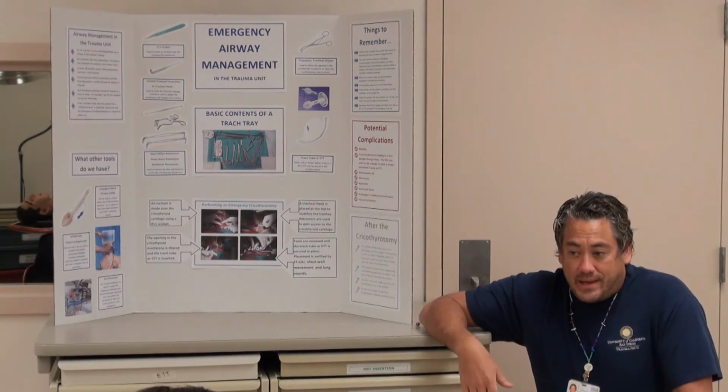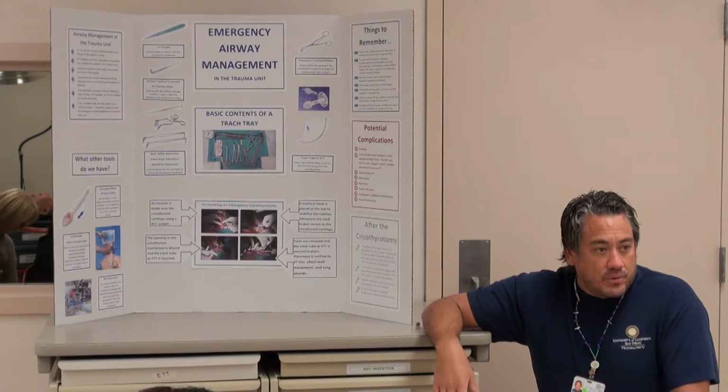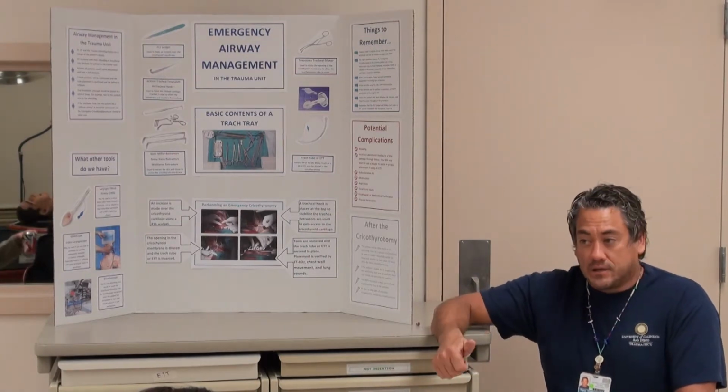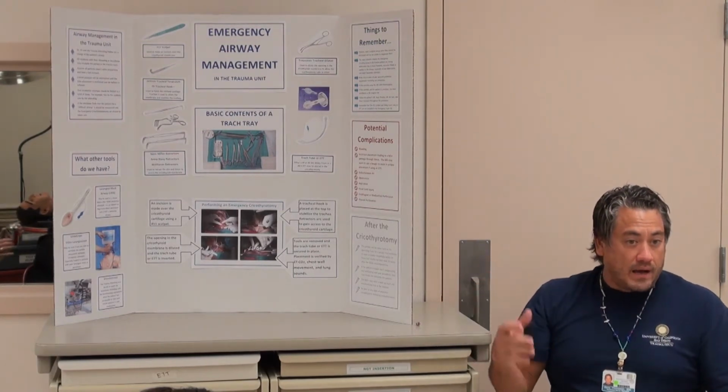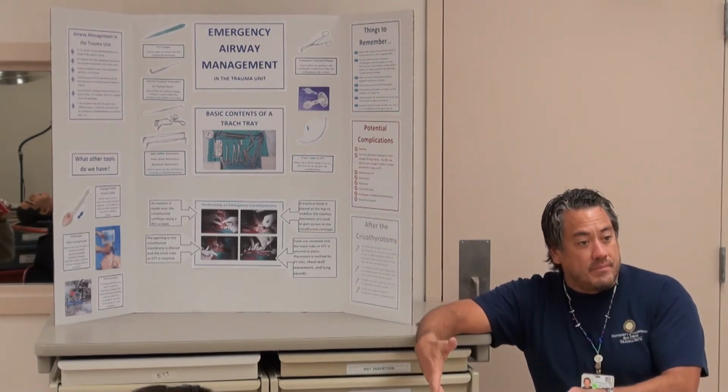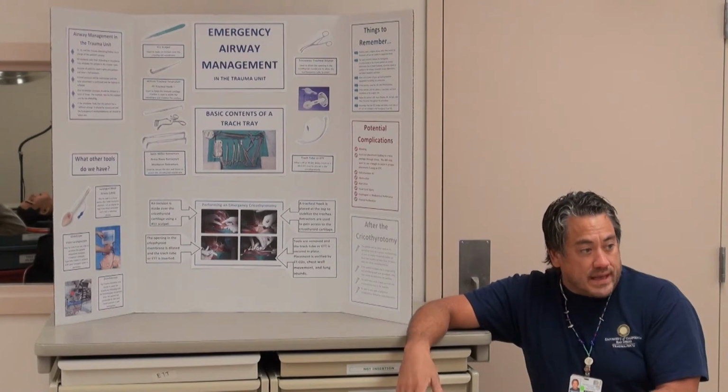We always assume that all of our trauma patients have a C-collar on, but you have to make sure that doc number one takes care of the C-spine during intubation because they're going to want the collar off. You need to have someone kneeling behind them in bed and holding that C-spine.